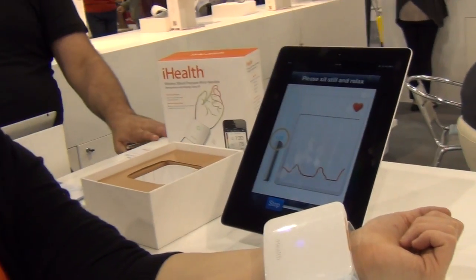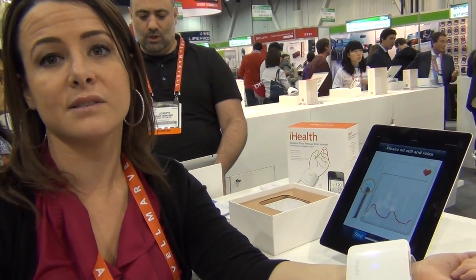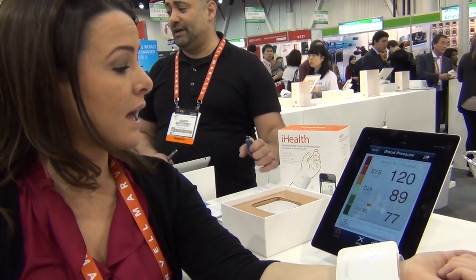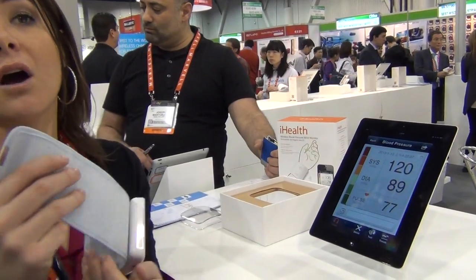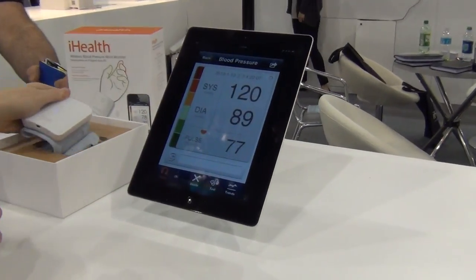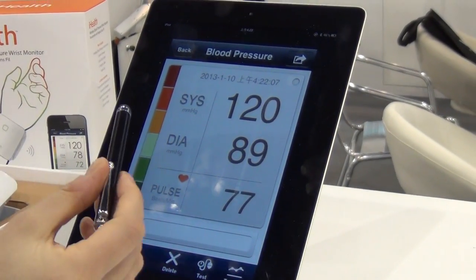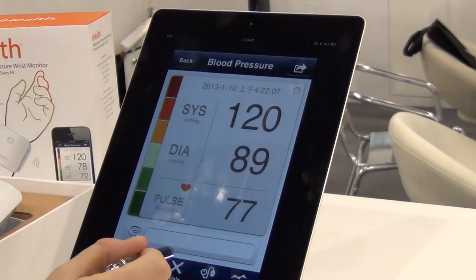iHealth has a suite of products that include blood pressure monitors, weight scales, as well as glucose monitors that work with our app called iHealth My Vitals. We have an iPhone app as well as an Android app which will be coming out shortly, where you can take your measurements and store your data directly on it.